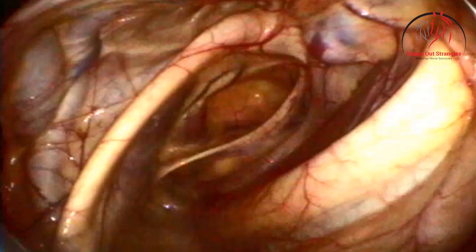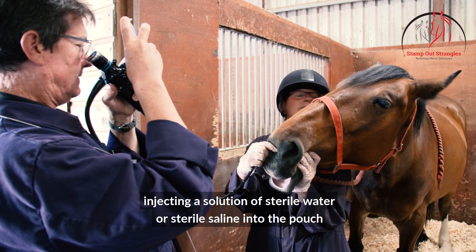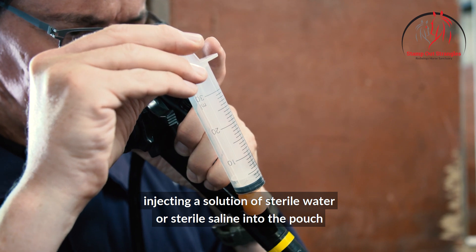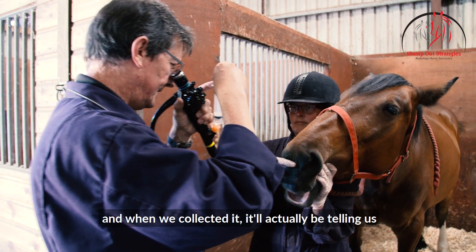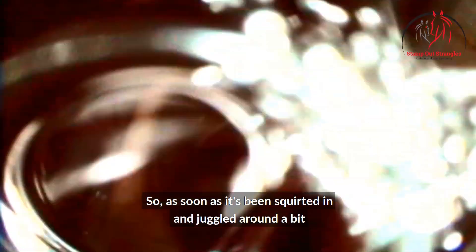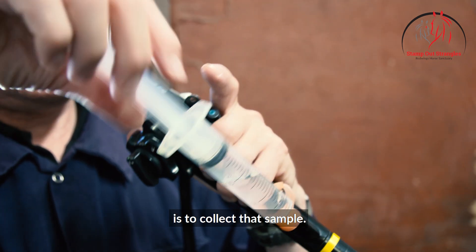We're in. Once the scope is inside the pouch we have a quick look round, and then we put the sample in, which involves injecting a solution of sterile water or sterile saline into the pouch. We ask our assistant to raise the head at that point because by raising the head it means that our sample will actually stay in the pouch, swirl around a bit, and when we collect it it'll be telling us what's going on inside the pouch. As soon as it's been squirted in and juggled around a bit, we get the scope into the puddle of water and suck it back up into our syringe — that's really the whole purpose of the scoping, to collect that sample.